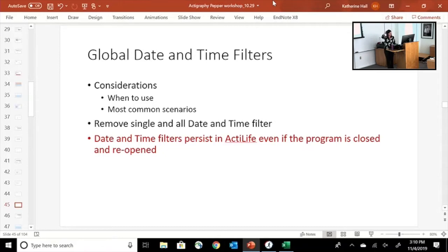Again, I rarely use it. The most common times that I see it is if we want to really specify in the absence of wear diaries, or when we have a lot of patients who wore it for a 24-hour cycle instead of only during waking time. I might apply a filter that says only from 6 a.m. or 5 a.m. to 11 p.m. And then anything in between that window is not included. Again, that takes a lot of consideration before you apply something like that, but it is possible, and some people do.